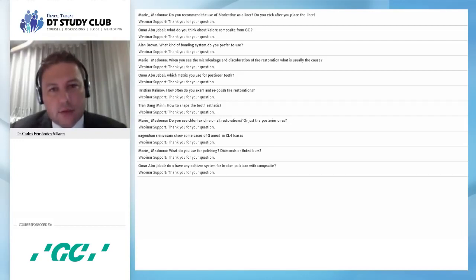I need to recommend that if you want to make a good, safe color match, you do it immediately when the patient comes to your office, and we do it with the lamp, and make two or three registrations, one by yourself and others with your assistants and the people that work with you.